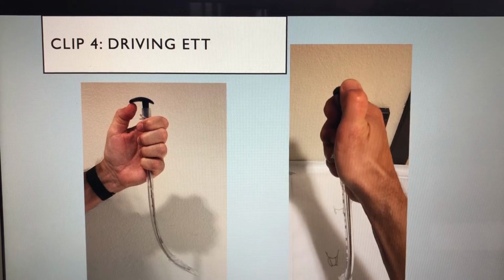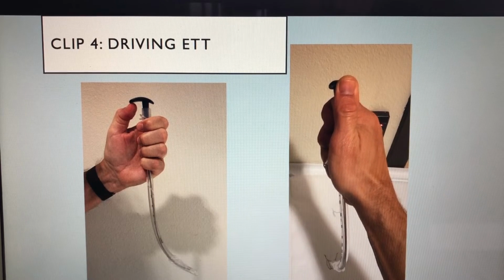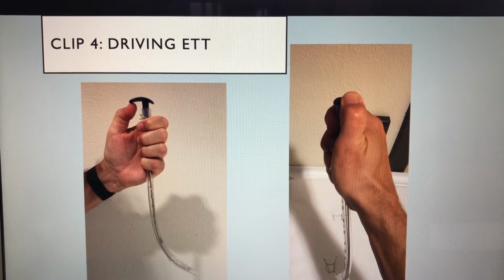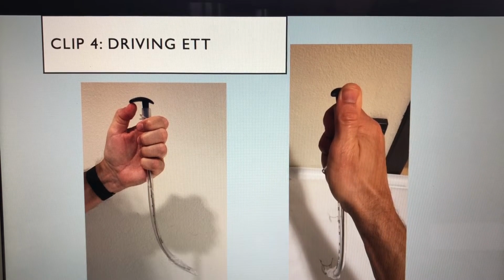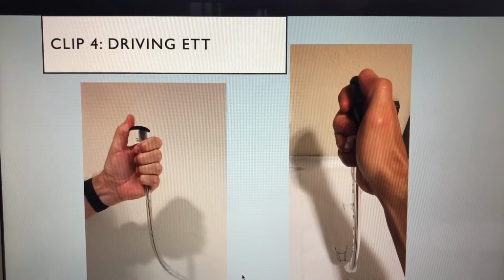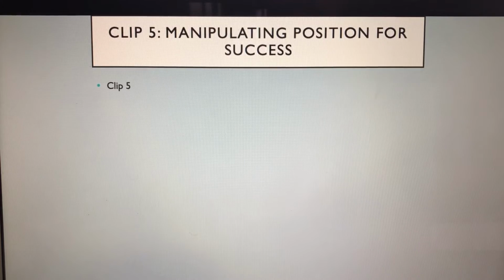Again, I'm below the cords. Move my thumb up some. It goes right to where I need it to be. If you happen to be off to the side and low, turn it to the side this way, and then I can lift up, and then I can advance. So manipulating the stylet can make a massive difference. Here you can see if I happen to get below. So I'm going to show you just again on the mannequin how you can manipulate the ET tube all you want to move it into the correct place.